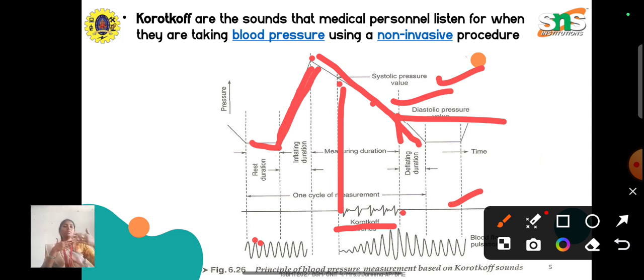When you compare these two graphs with the blood flow, in the resting state you have normal blood flow, which is the sine wave you can see here. Then, during inflation, this sine wave starts to gradually reduce. You can see the gradual decrease of the sine wave. The reason is that as your cuff keeps on inflating, it shrinks and contracts your blood vessels. When your blood vessels keep on contracting, it automatically disturbs the blood flow, so the sine wave keeps on decreasing here.